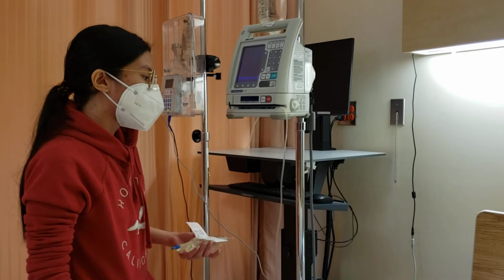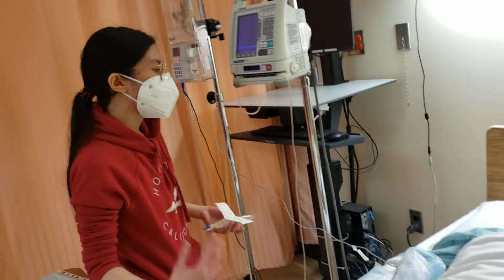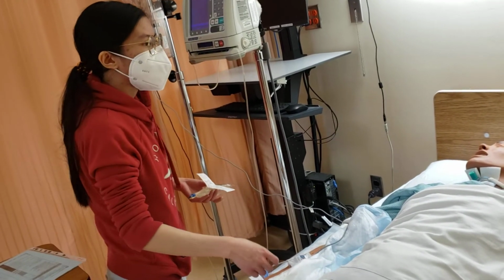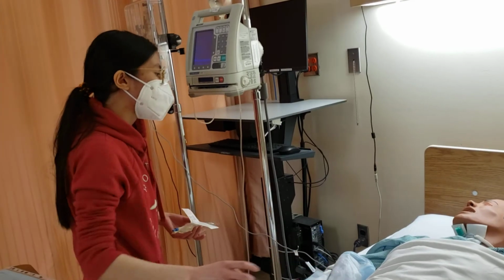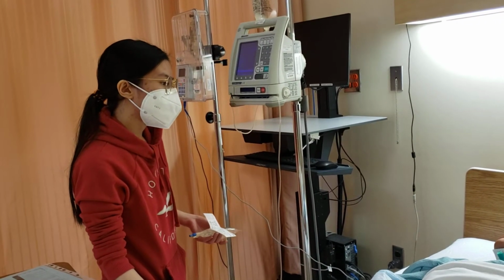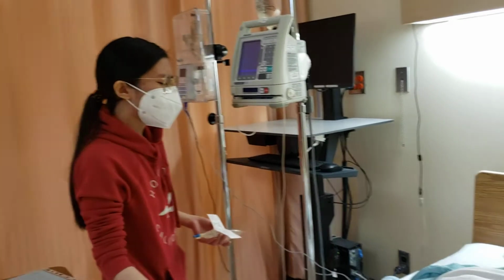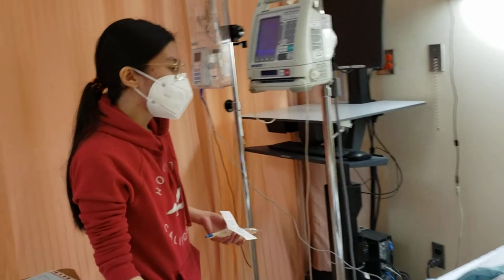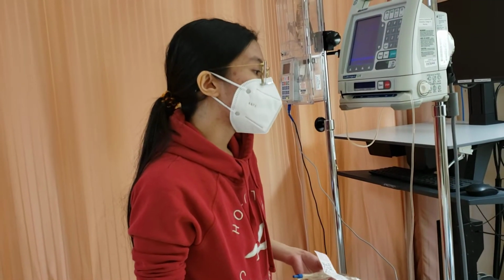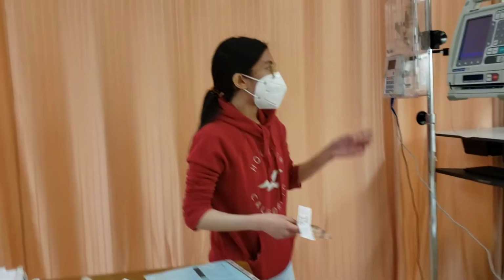If you have any unusual feeling after you got that medication, it's important that you tell me, and you can use the call bell. The call bell will be just right on the other side of your bed, and you can use that to call me if you feel any shortness of breath or dizziness, or if you feel any hives or any itchiness or anything unusual, and you consent that I give you this medication. Okay, I've got the consent of my patient, so I'll just ready my PCA.